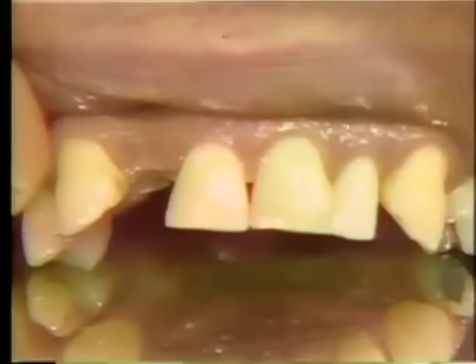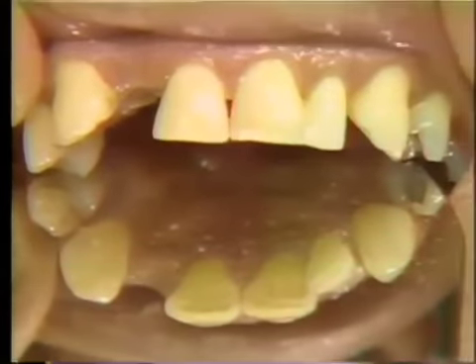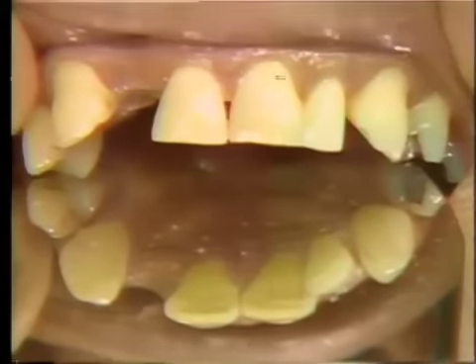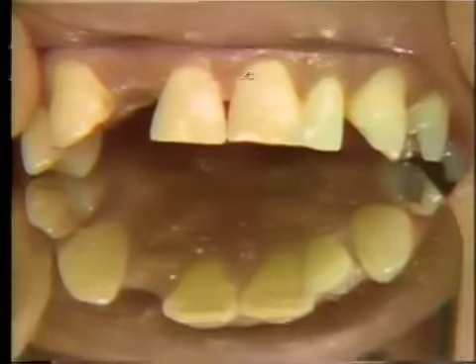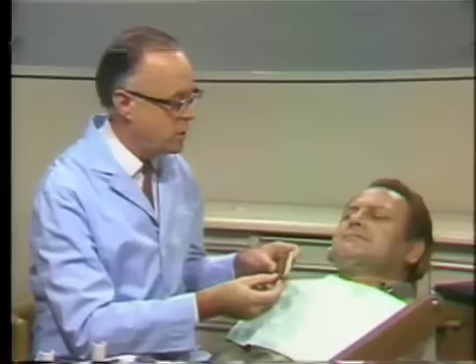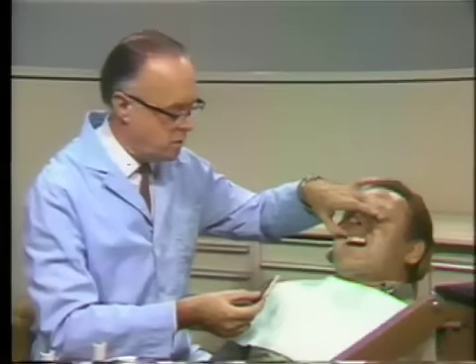We have already taken impressions for study casts of the maxilla and mandible, and our next step is to select the shade for the Pontic facing in this particular case, and that's what we'll now do. As we're using the long pin facing for this situation, we shall use the Bioform shade guide in selecting the shade for this particular case. And from past experience of this type of situation, looking at these particular teeth, one gets a pretty good idea that it's going to be somewhere in the 66, 67 range.